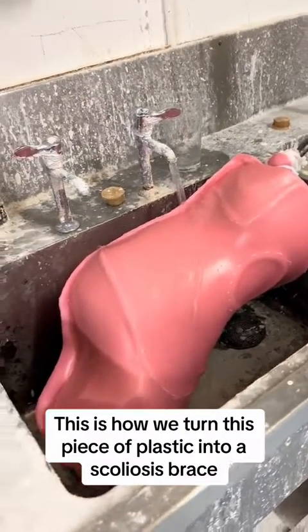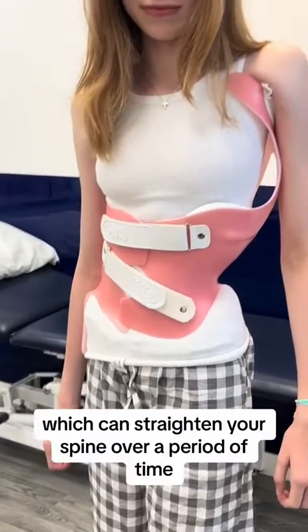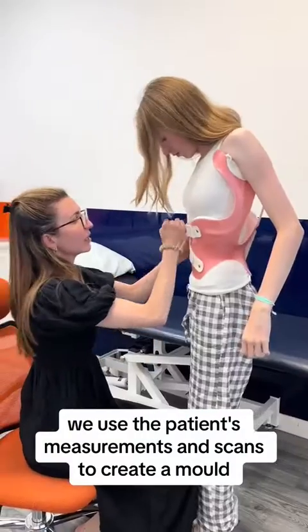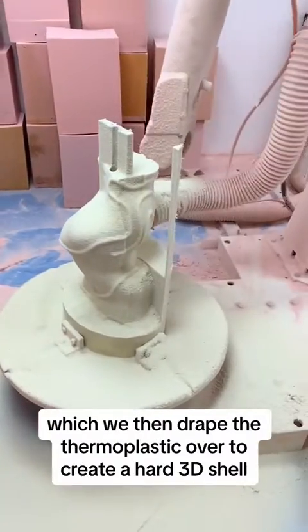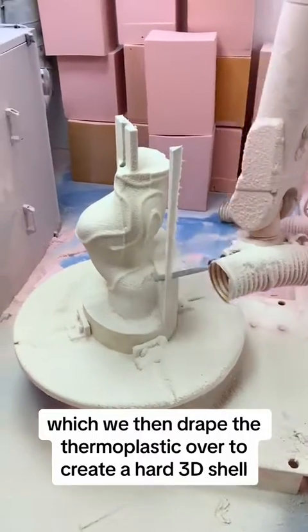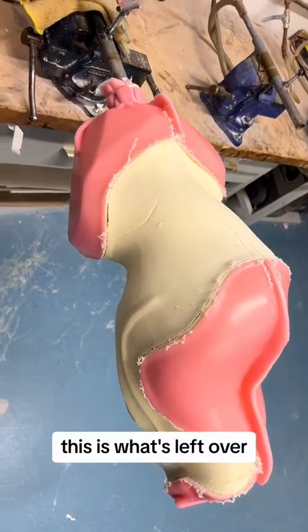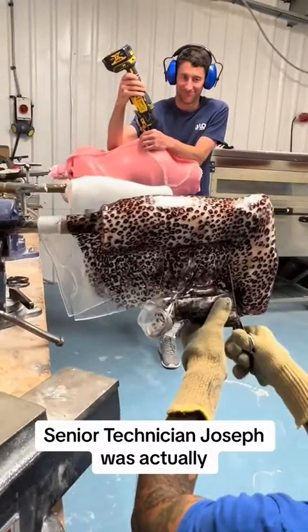This is how we turn a piece of plastic into a scoliosis brace, which can straighten your spine over a period of time. We use the patient's measurements and scans to create a mold, which we then drape the thermoplastic over to create a hard 3D shell. After cutting it out, this is what's left over.